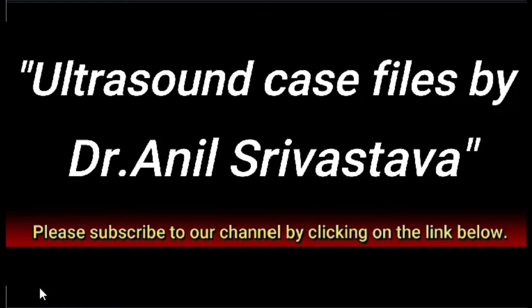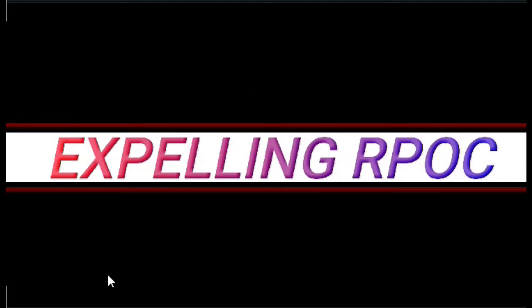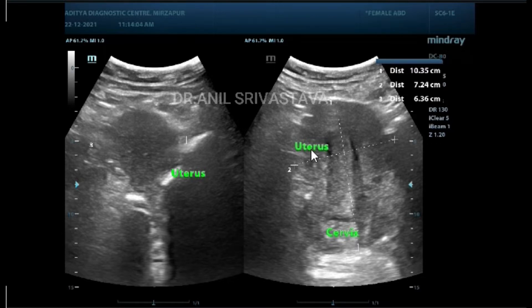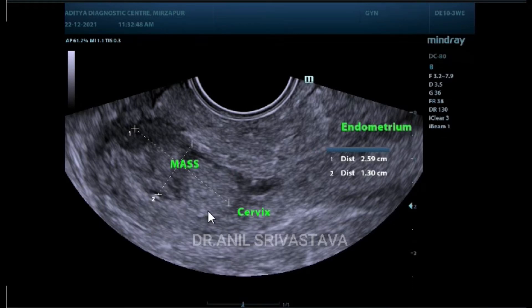Hello friends, good evening. Today I am presenting a case of expelling product of conception. You can see the uterus here — this is the uterus, this is the cervix. The mass is present in the lower part of the endometrial cavity and the endocervical canal.